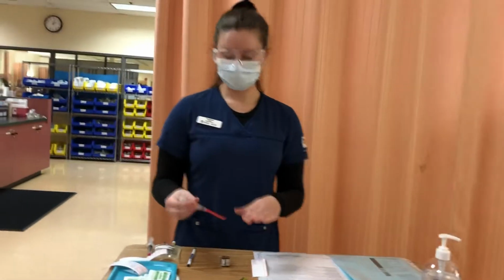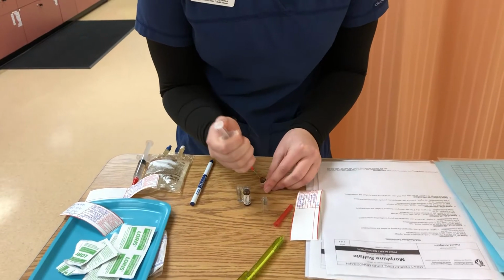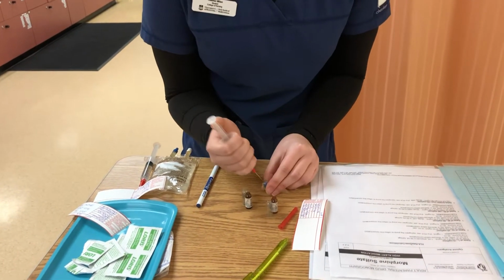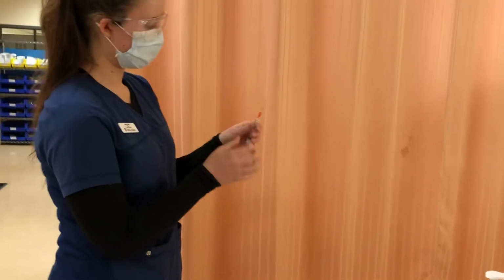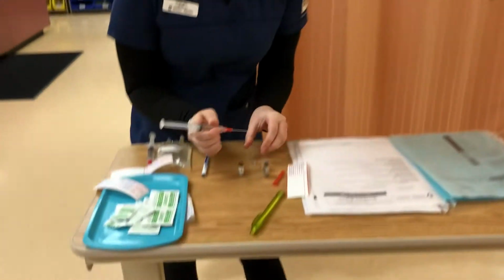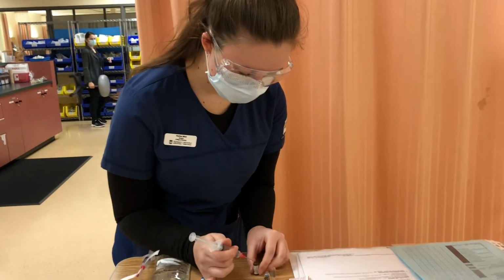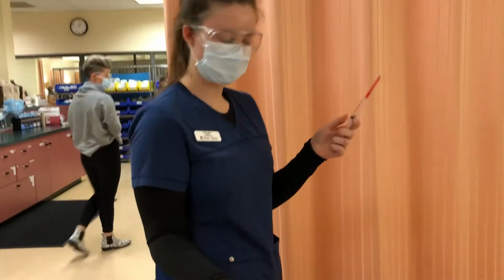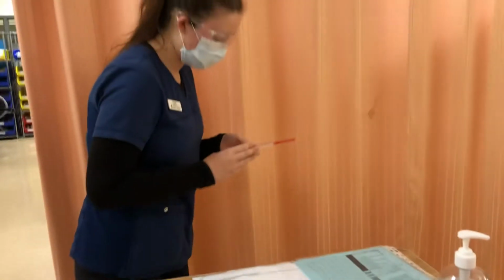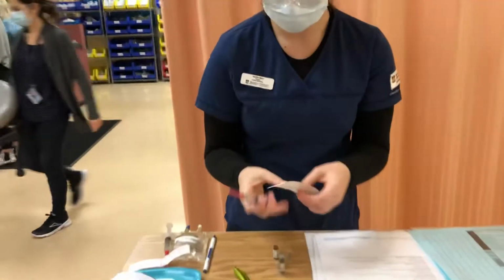So in clinical practice, I would have broken and cleaned these all appropriately. So I'm drawing up 1 milliliter from each of these ampules. I'm just going to get a little bit of air out of here. And again, I'll just get a little bit of air. Great, so I'm going to make sure that I do in fact have 5 milliliters here. And I see I've pulled up a little bit extra, so over the sink I'm going to be med wasting what I'm not using. And here I have 5 milliliters, 5 milliliters. So I'm going to be labeling this.